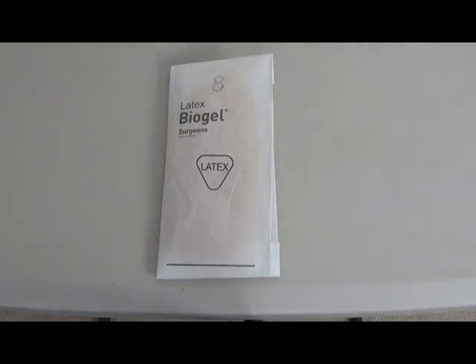Here's a simple Biogel glove that we use in the OR sometimes for prepping or for catheter Foleys. Now, in the catheter Foley kits you do have gloves, but even though they're smaller, the packaging is similar. They do have a similar type of folded edges that I will show you in a second. So hopefully you can translate it to that too. So here we're gonna go.